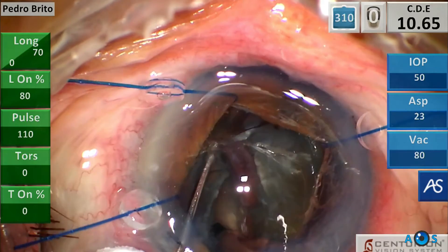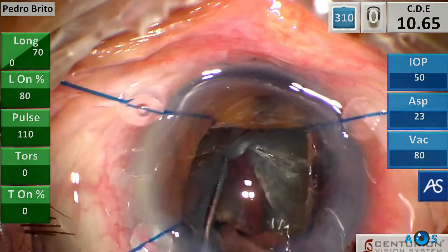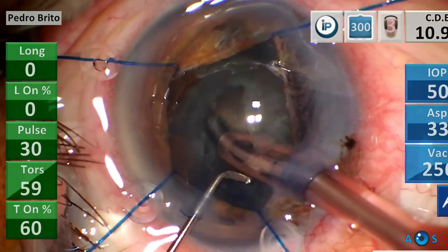A successful split is achieved. Now using high vacuum, the HEMI flip technique can be used to bring the hemi nucleus part to the center for emulsification.